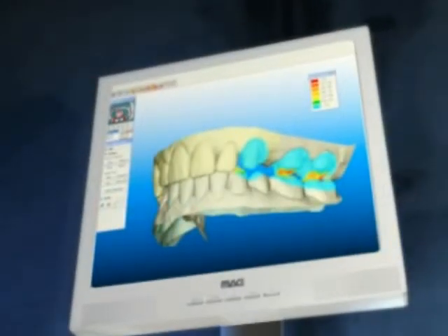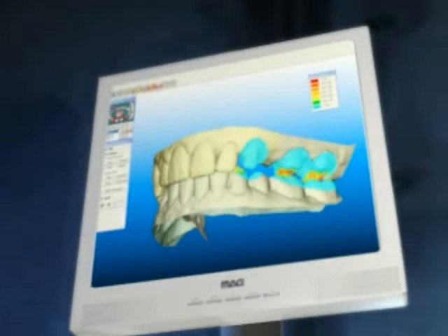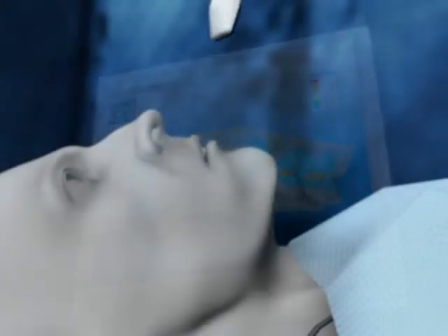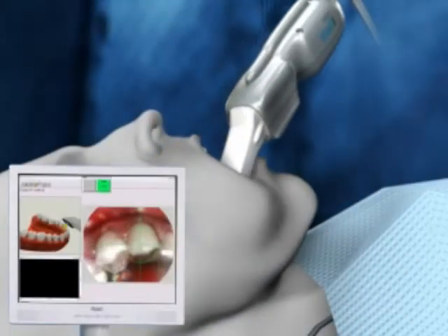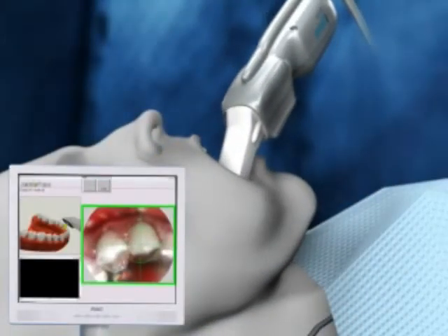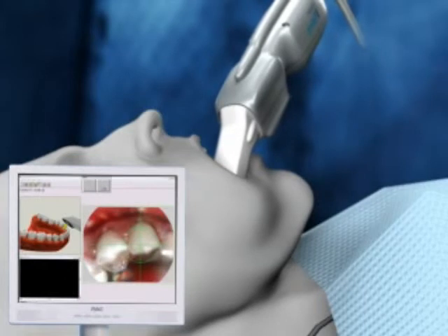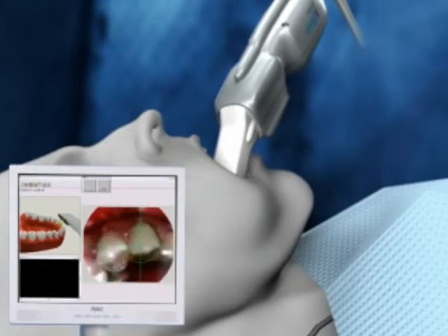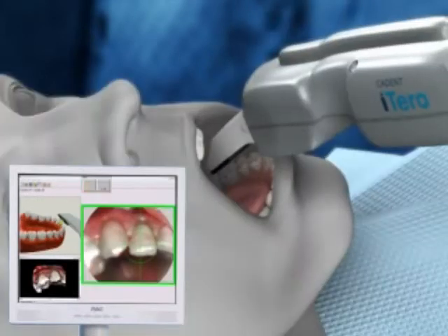With the ability to scan quadrants as well as full arches, Cadent iTero allows the clinician to obtain digital impressions of single and multi-unit cases. Real-time, on-screen visualization of the digital scan enables simple self-correction of the tooth preparation for optimal results.